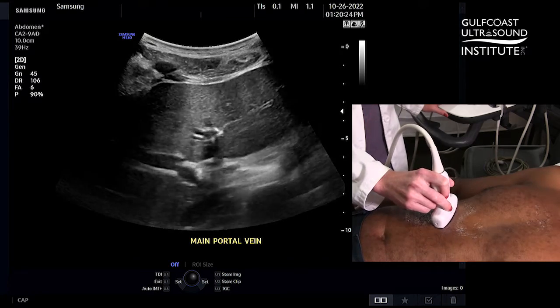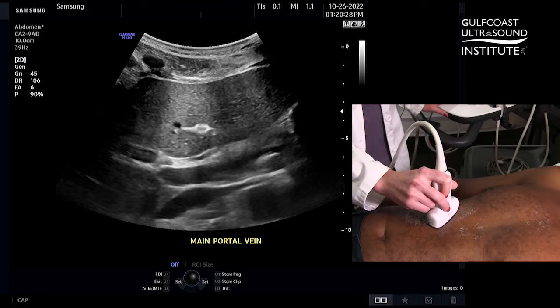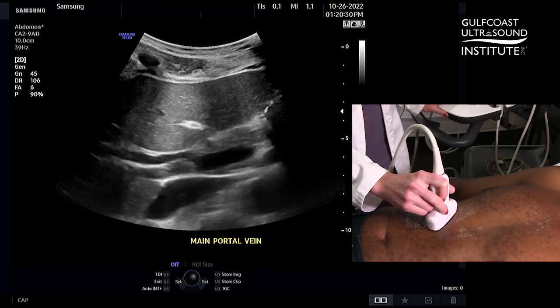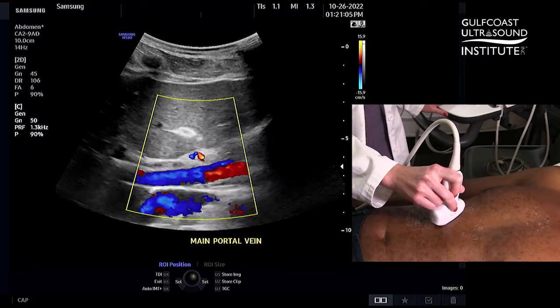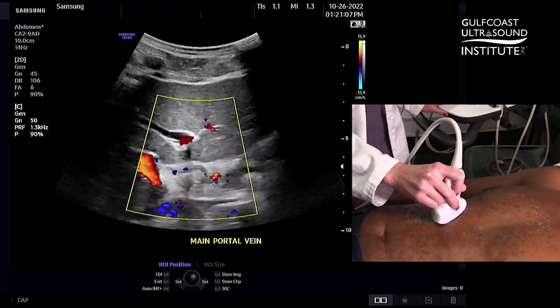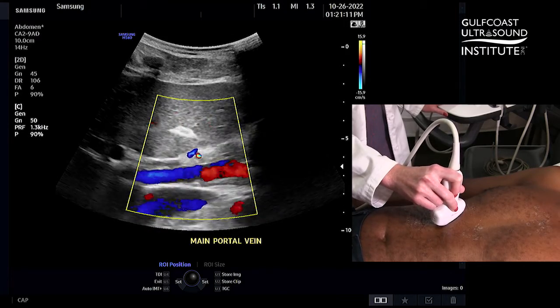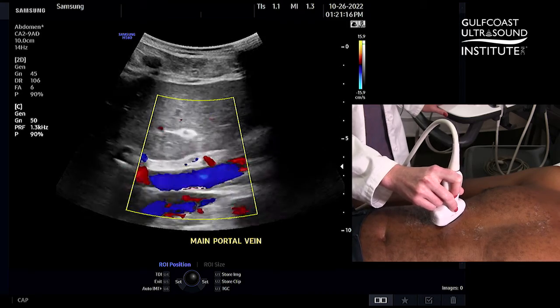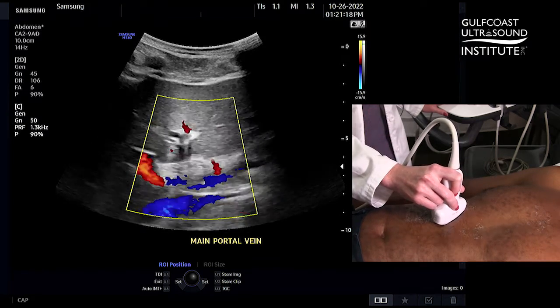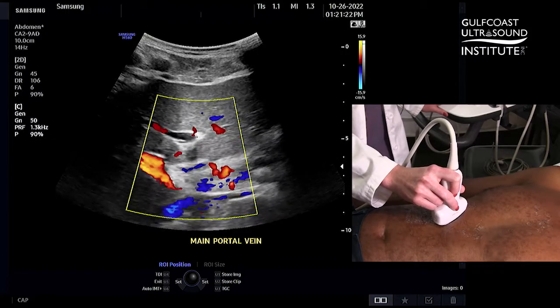Scanning from midline to see the main portal vein is a great way to see the walls and also identify the common bile duct. But when we turn our color Doppler on at 90 degrees, you're not going to get great fill because of your angle of inclination. Also, the main portal vein appears blue, which is the correct direction from this orientation, but it's better if we can show it red with appropriate hepatopetal flow.